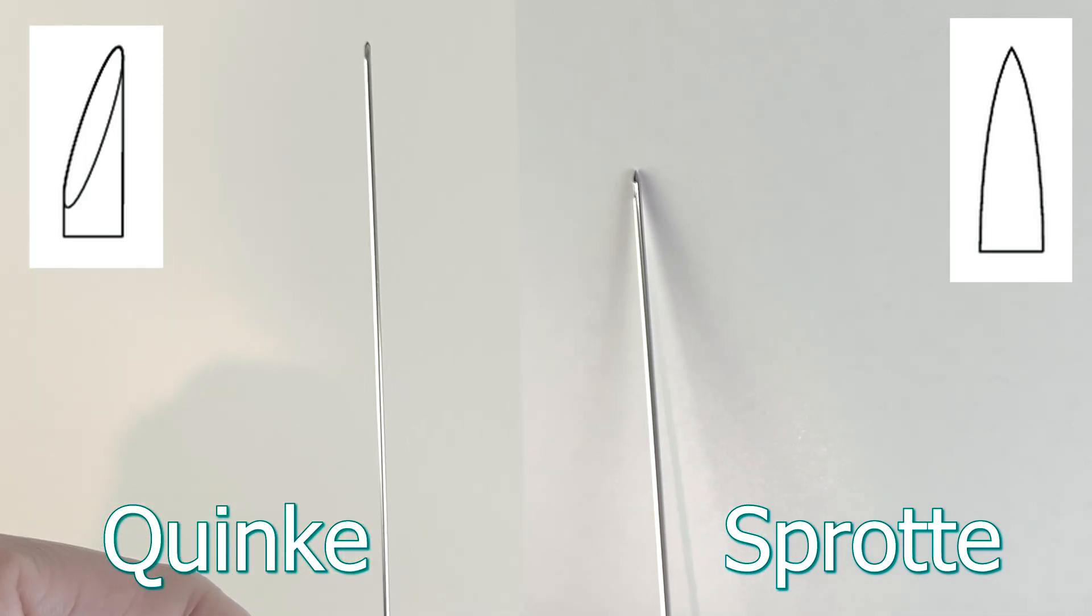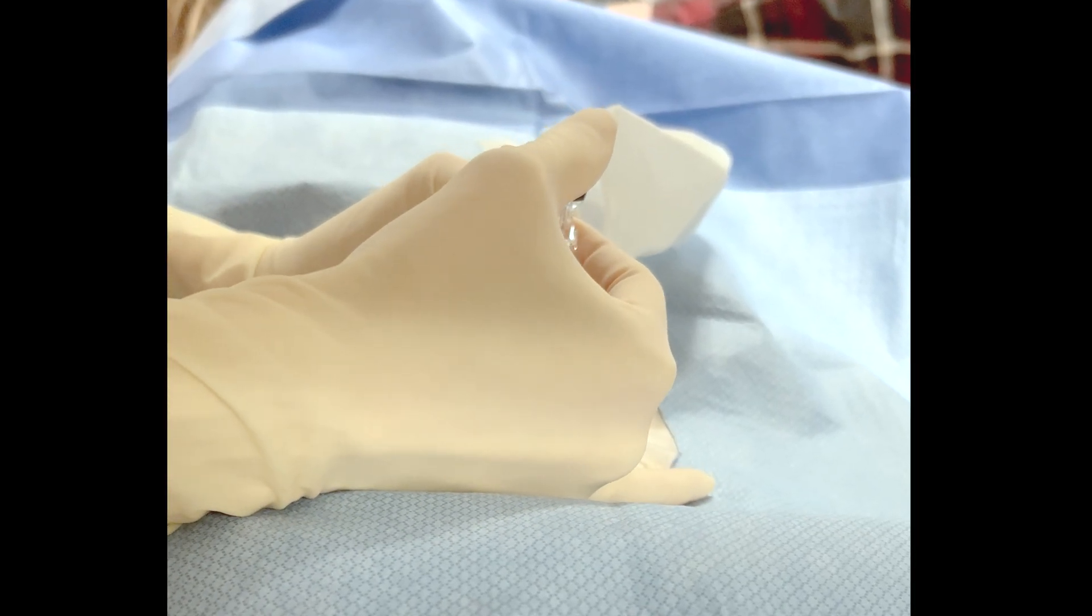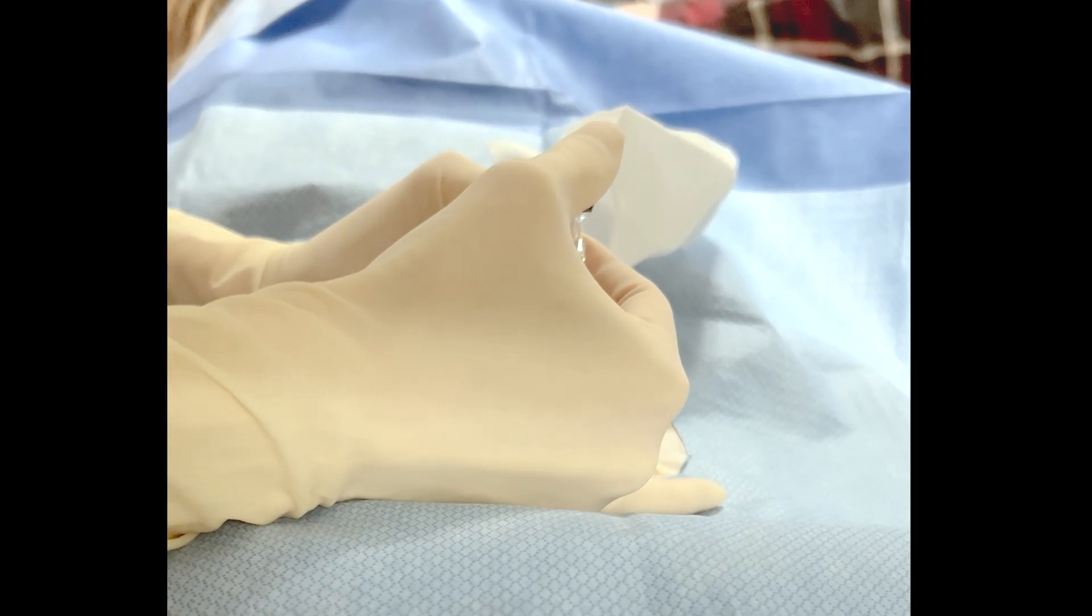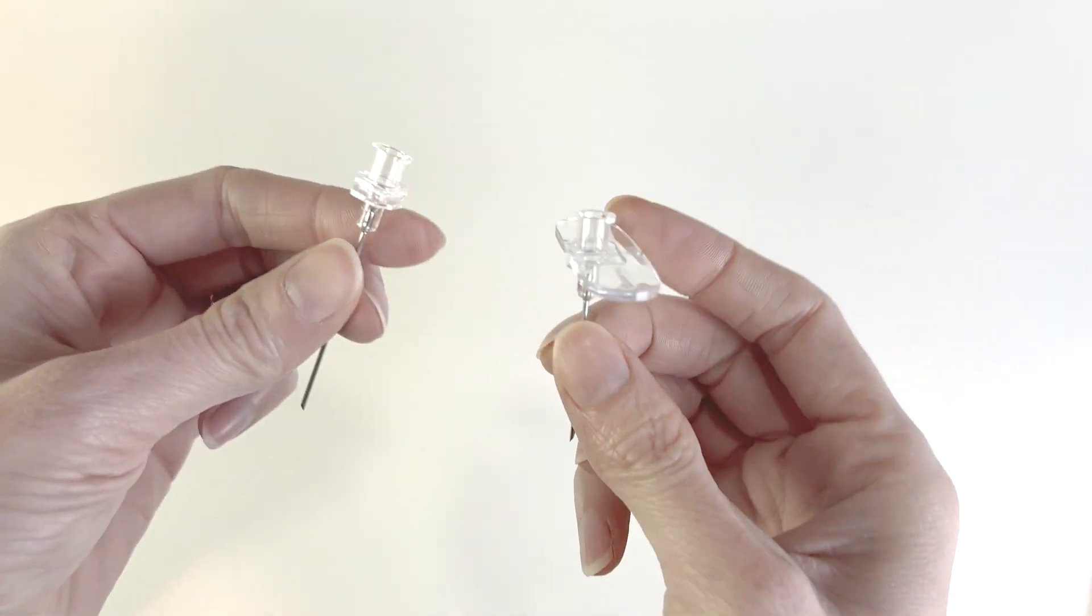It parts the dura rather than cutting it. The downside is that it's quite blunt feeling, so it takes quite a bit of pressure to get it through the skin. That's why we have introducers.